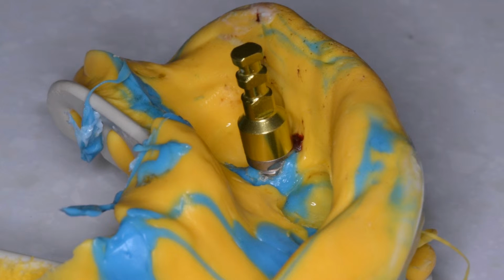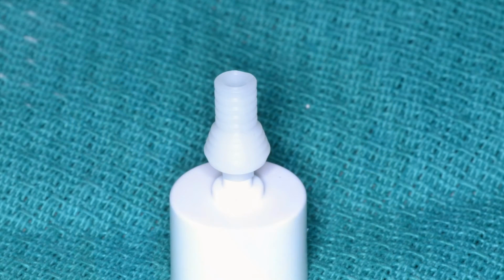And in this picture, you can see a close-up here. You want to make sure that fixture analog has been adapted appropriately, just like we take an x-ray to make sure that the actual impression coping is sitting on the implant fixture. Clinically, when you put this thing in, you want to take a close peek and make sure that you don't have a gap there. There's no micro gap, because this will lead to lab error.